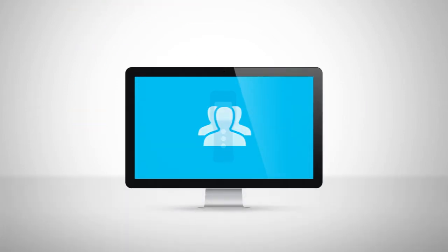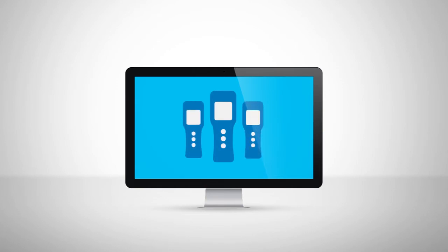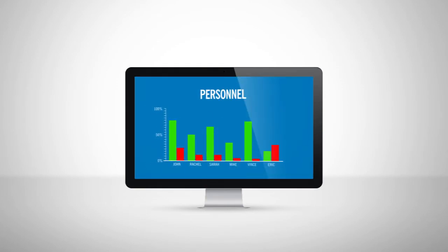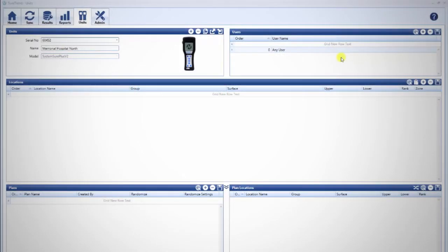Adding usernames to your unit is a great way to track EVS staff performance to help with accountability, teamwork, and training. Open SureTrend.